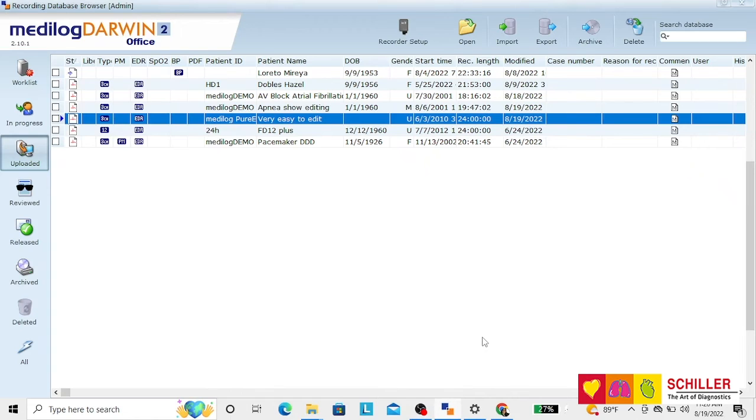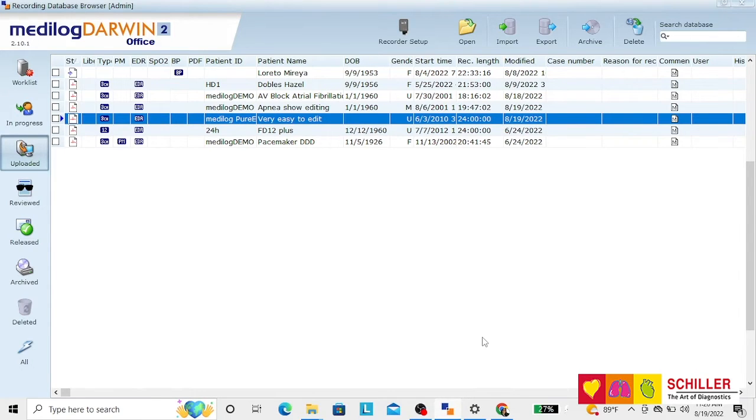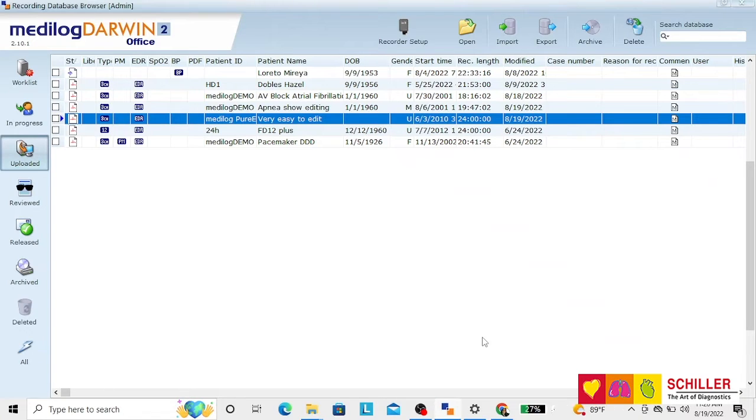Medilog Darwin recording download. Take your USB cable or your SD card and insert it to the computer directly.